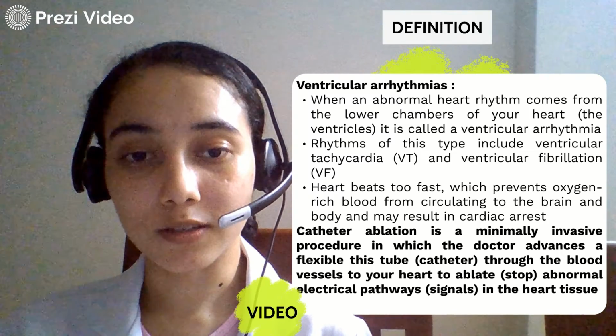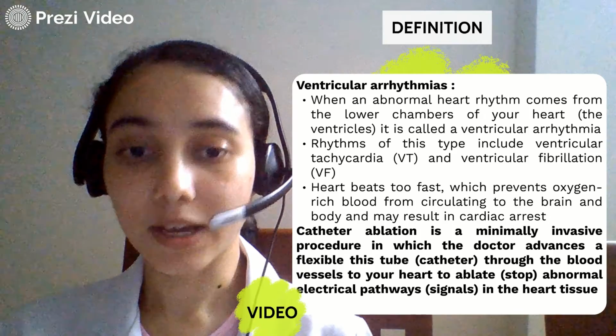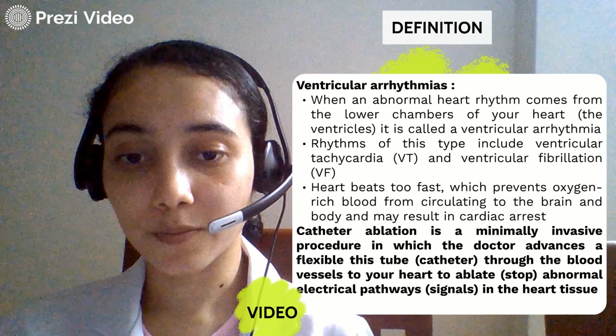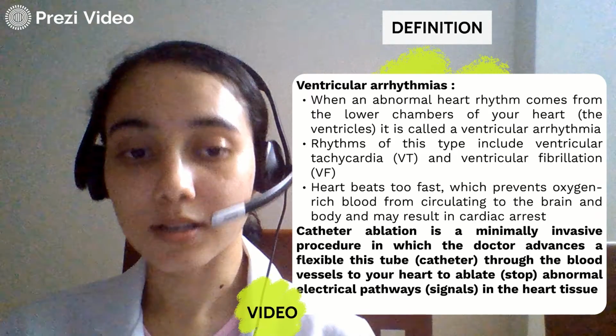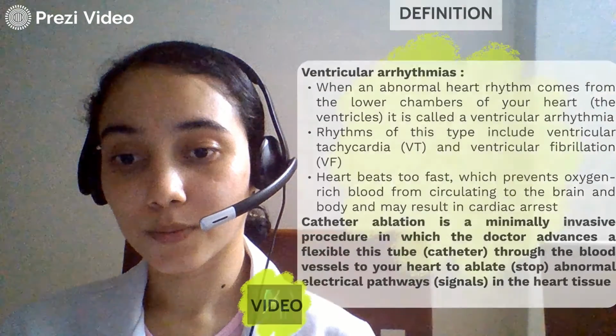Heart beats too fast, which prevents oxygen-rich blood from circulating to the brain and body, and may result in cardiac arrest. Catheter ablation is a minimally invasive procedure in which the doctor advances a flexible tube catheter throughout the blood vessels to your heart to ablate, stop abnormal electrical pathways in the heart tissues.